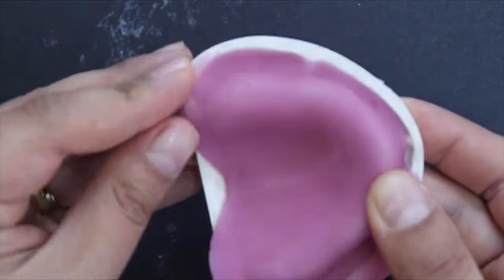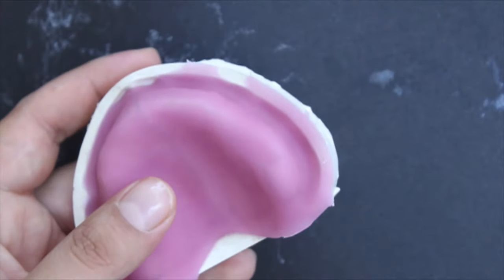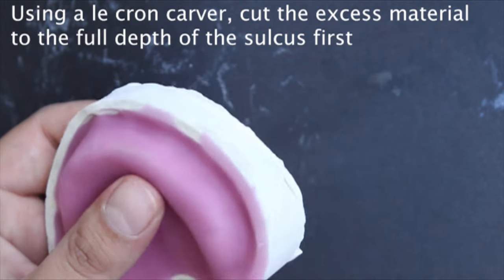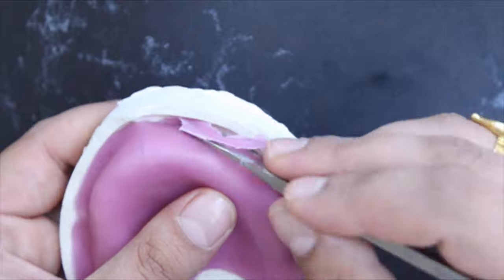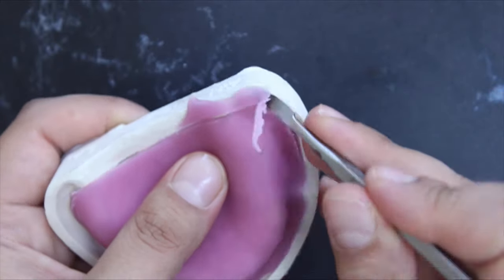Use a sharp lacron carver to trim away excess material according to the second line you drew earlier — the one that is 2 mm away from the depth of the sulcus — to provide enough space for the tracing compound material to border mold the peripheries of the denture bearing area. Make sure that you provide enough space for freedom and that you follow the anatomy of the denture bearing area.